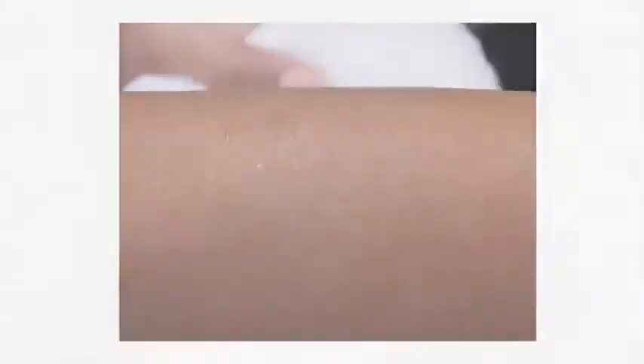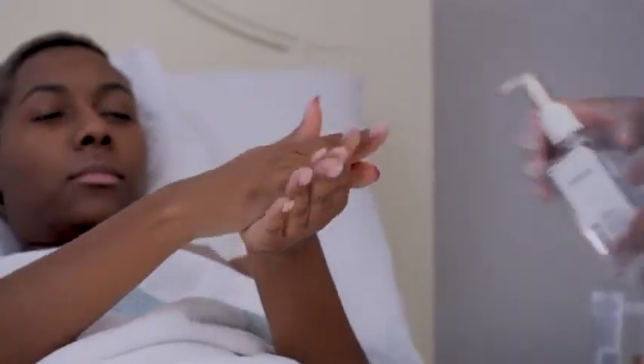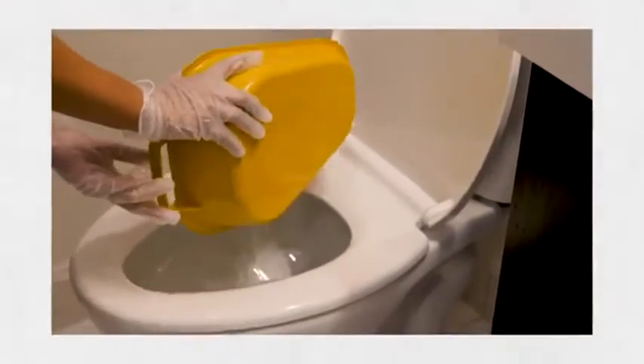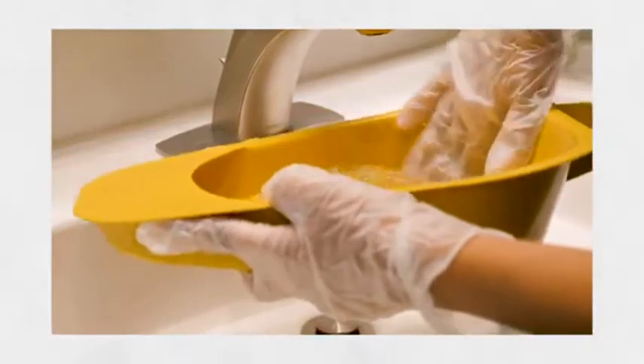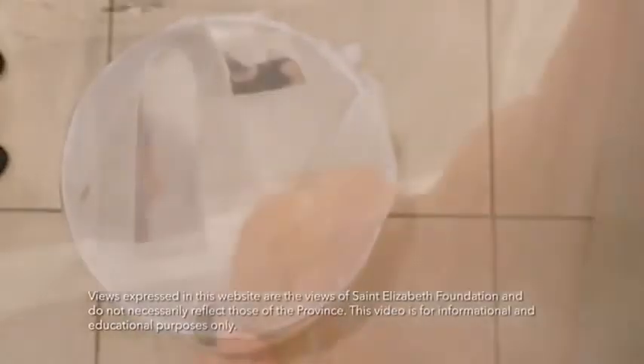Damp skin can lead to rashes or bed sores, so ensure their skin is dried well. Discard the bed pad and apply any creams they need. Finish up by fixing their clothes and bed linens and encouraging the person you're caring for to wash their hands with sanitizer to help prevent infection. To clean up, empty the bed pan contents into the toilet carefully. If you used wet wipes, put those in the garbage — they shouldn't be flushed down the toilet. Rinse the bed pan thoroughly each time you empty it and clean regularly with soap and water. Last but not least, wash your hands thoroughly after removing and throwing out your gloves.